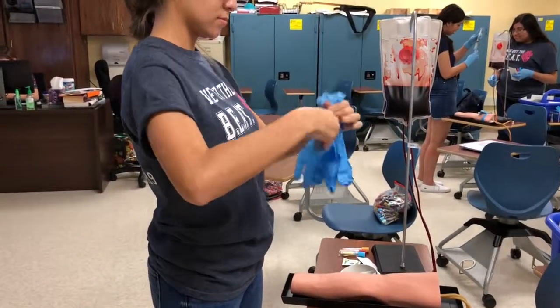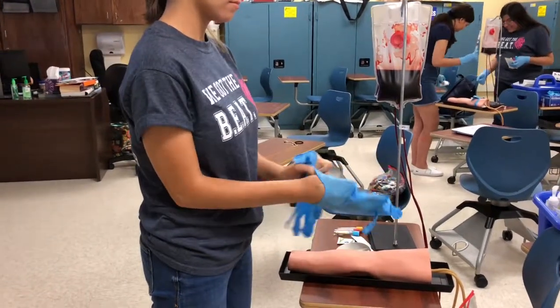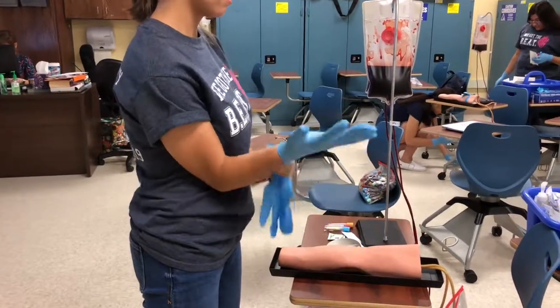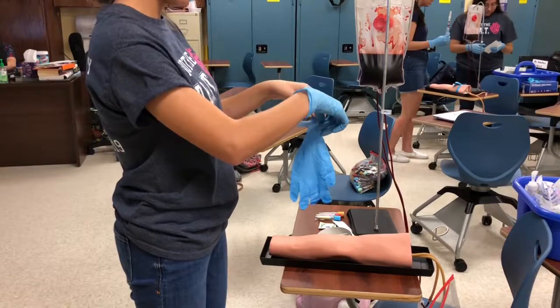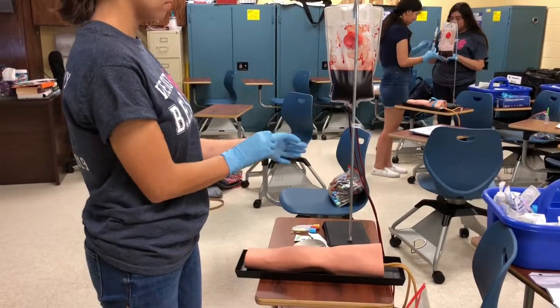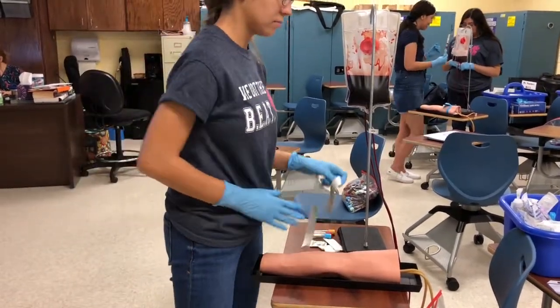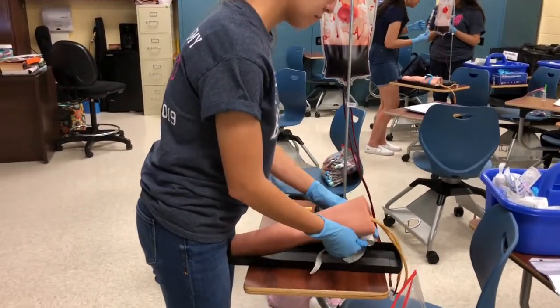Now I will be putting on my gloves. Now I put the tourniquet on. I warn the patient it might be a little tight.